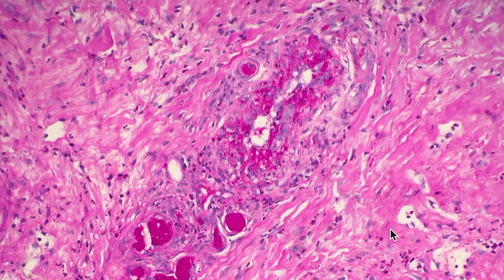Here's an example of that same case of cryoglobulinemia, and you can see that the deposits inside the vessels are bright pink on the PAS, periodic acid Schiff, stain. So the PAS is highlighting the cryo material that's depositing inside the vessel lumens. You can see it here, here. It's really nice, very, very dense on H&E, and very deep, bright pink staining on PAS stain that can kind of help you to distinguish it from background fibrin, which will also pick up PAS to some extent, but I feel like the staining is much more intense on cryoglobulins.